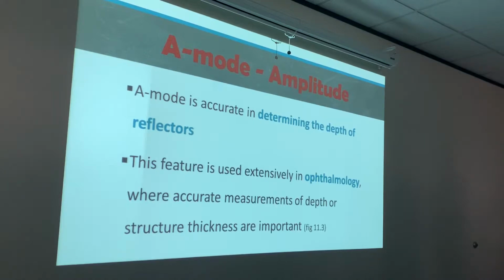They can use a regular transducer, but you're not going to see anything. Most of the time when doing a transcranial Doppler, they use a continuous wave transducer. While they're getting the circle of Willis, they'll also check the ophthalmic artery in the eye. They'll put gel on the eye and a transducer right there and get the velocity or the amplitude of the ophthalmic artery.